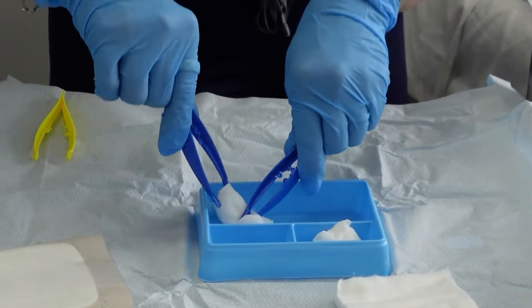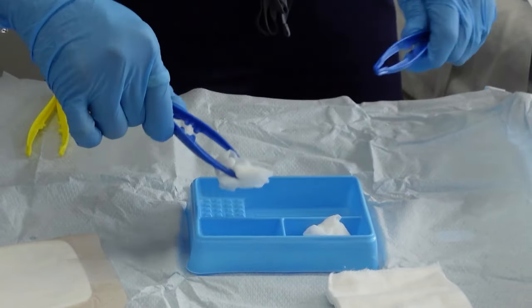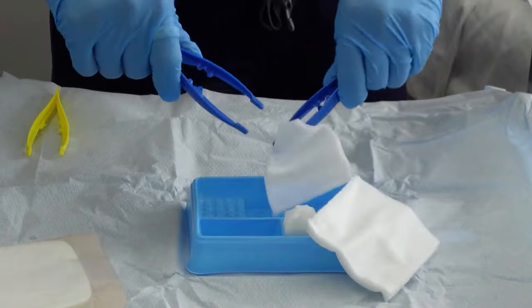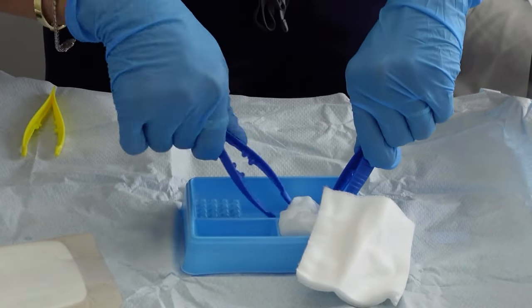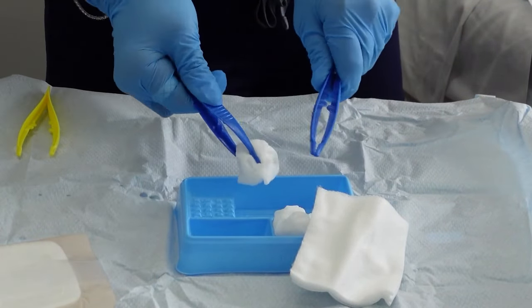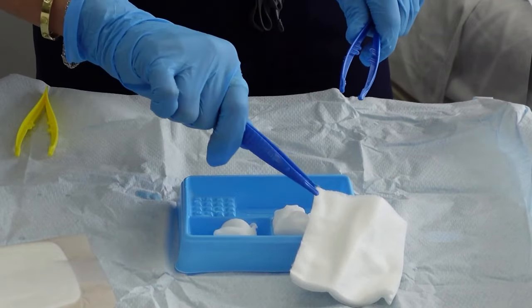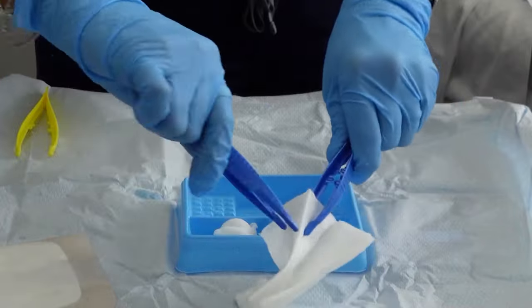You can now prepare your gauze that you're going to use to clean the wound. Ideally, if it's a simple wound dressing, three gauze would be enough. While I'm preparing my gauze, I'm very careful not to touch any of the sterile field. Remember, your gloved hands are also unsterile, and that's why we're using the tong to prepare our gauze. We usually leave one or two gauze to dry the wound.